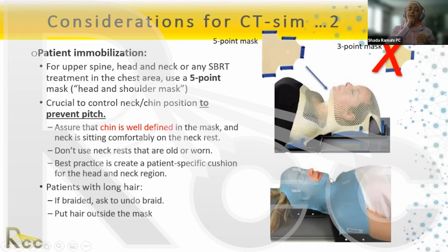Fixing the chin pretty much fixes your entire head and upper neck. What you want to do is pay attention when you're aligning the mask. You try to take all the contour around the neck.